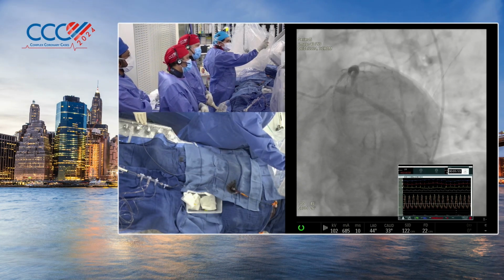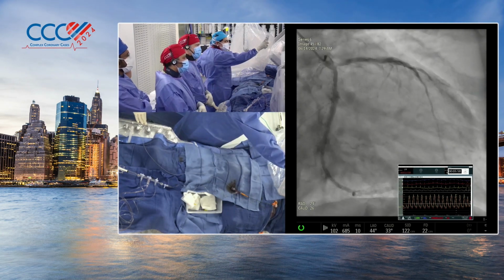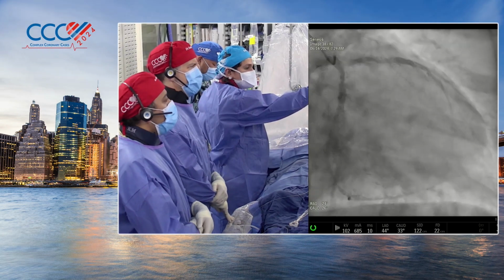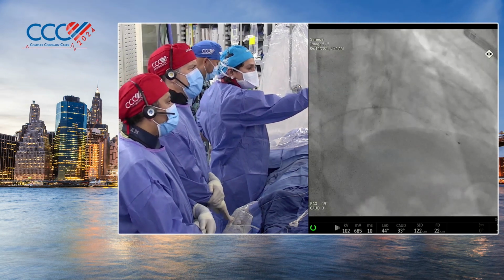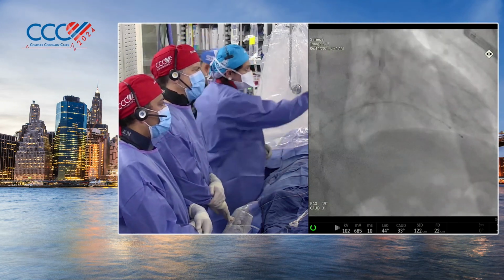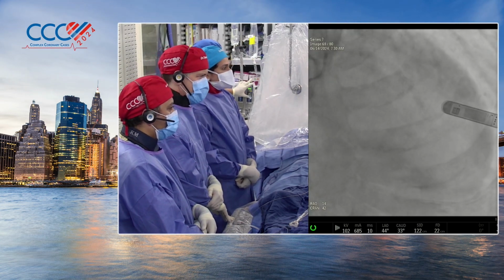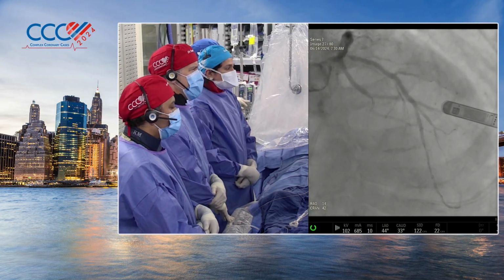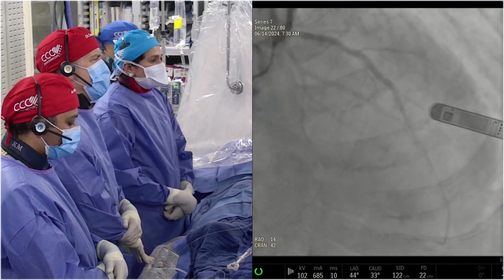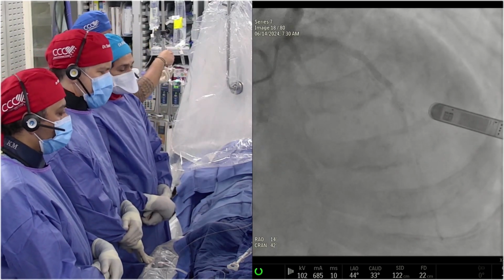You see that OM2 is totally occluded. That was another reason we got a surgical consultation. Though the LAD stent and the circumflex stent are patent, the small vessel stent is occluded. His RCA was okay. Right heart cath showed PA pressures of over 80 and wedge of about 30. We got an invasive gradient of about 30, with the Fick cardiac output of 5.4.